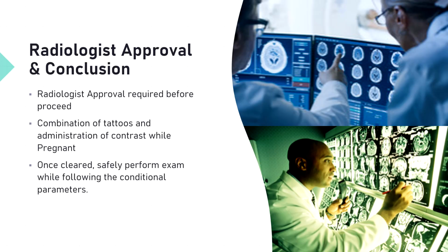Does this case require radiologist approval? Yes, absolutely. The radiologist must perform a risk-benefit analysis regarding the pregnancy and the necessity of contrast for headache diagnosis. As shown in these reference images, our primary concerns are avoiding thermal burns at tattoo sites and ensuring the safety of the fetus.